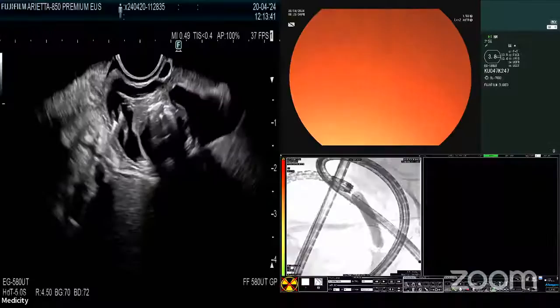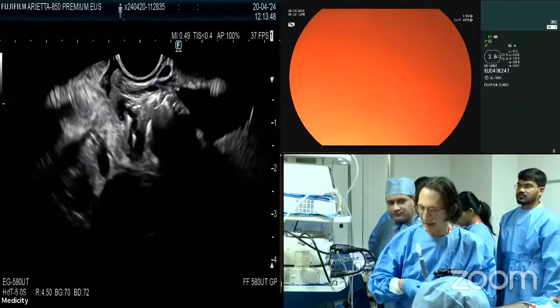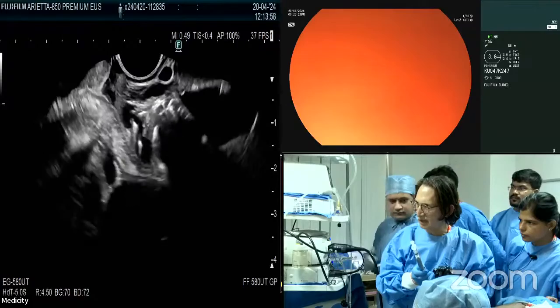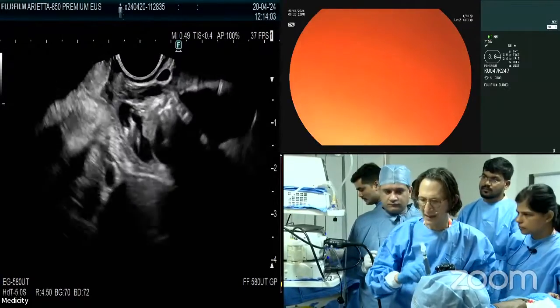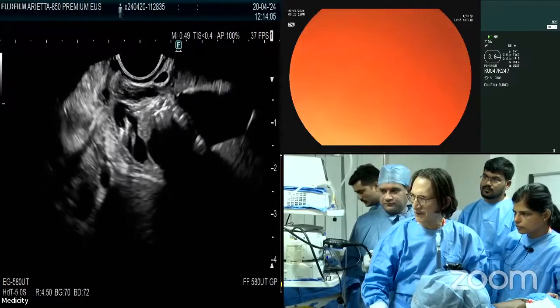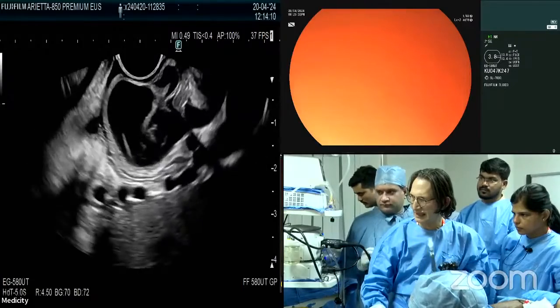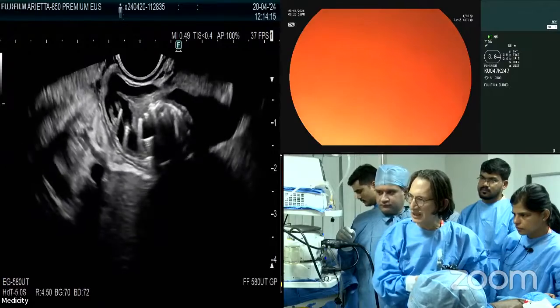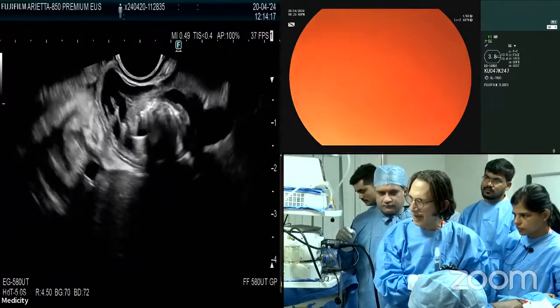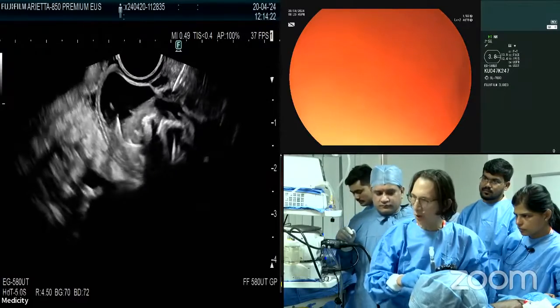Just holding this position. I'm going to advance the sheath out first — very important — the sheath is out. Now I advance the needle out just to see where it's coming out. There it is at the top. I just have to target now where my coils are, targeting that spot. The only disadvantage is I now have a lumen filled with coils, but the good news is it's going to hold.